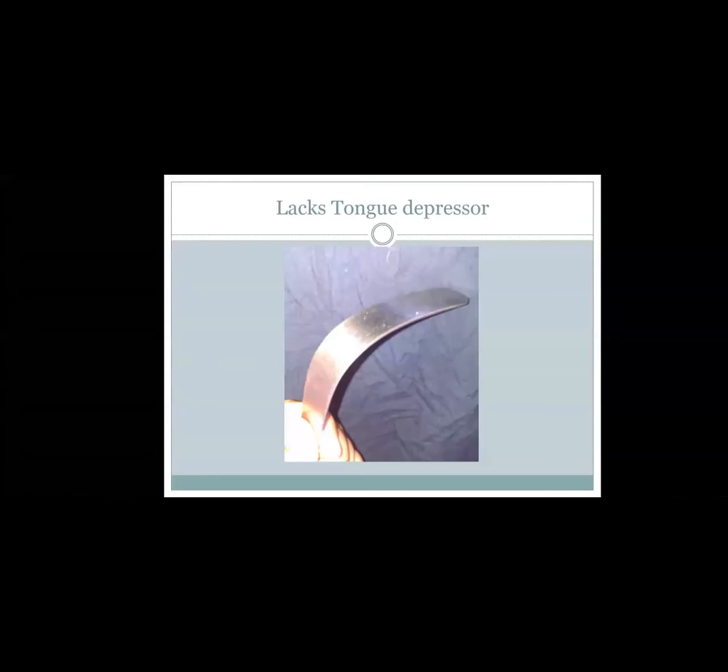The oropharyngeal structures, you will not get a better visualization, so you use this L-shaped tongue depressor. This depressor is helpful for, as the name indicates, depressing the tongue so that the oropharyngeal structures are better visualized. While taking the class itself, I will deal with all the instruments simultaneously. I've already told you Bullseye lamp and head mirror. The third one, I'm covering the tongue depressor. So you need not have an instrument lesson separately. A few instruments alone you can see in the book, in the last few pages. So this is a tongue depressor.